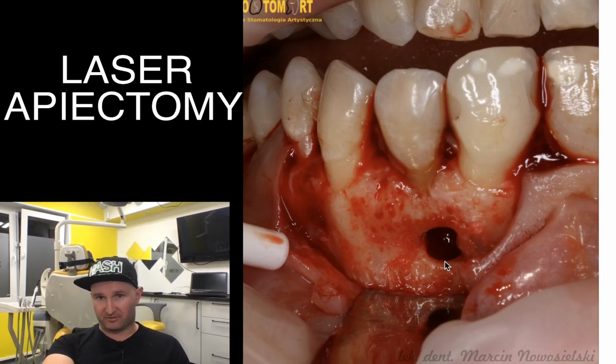This deep disinfection we will do with neodymium laser, and it will take 2 sessions of illuminating the area with the same 1064 nanometers laser light that penetrates deep inside the tissue and is absorbed also in the tissues, but also in bacteria.